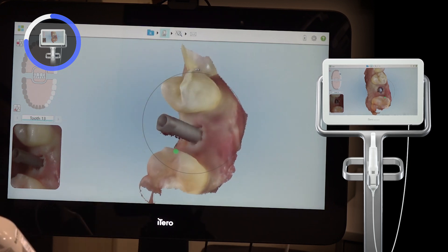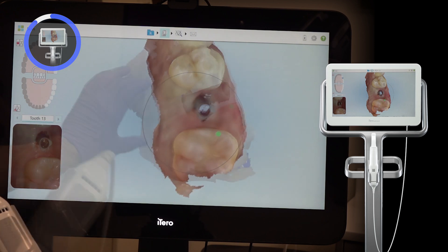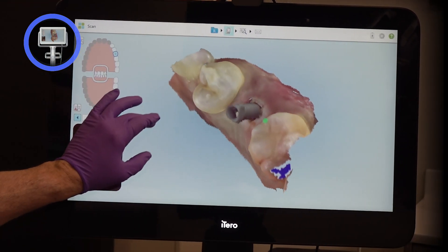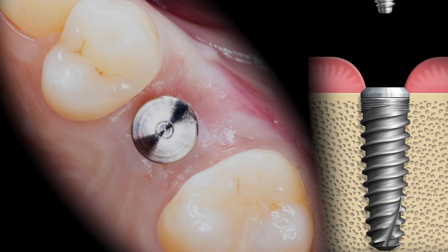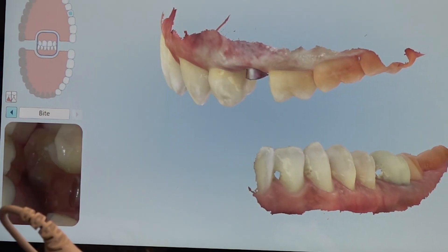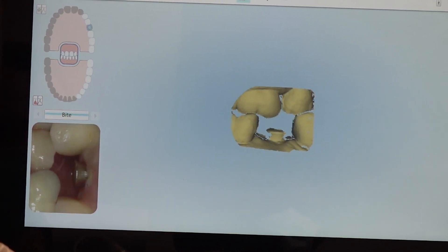The preliminary implant scan is erased and the implant scan body is captured once more, making sure the geometrical pattern is clear on the scan. I also double check to make sure the adjacent teeth are not missing any data. At this point, the scan body is removed and a healing abutment is hand tightened into place.